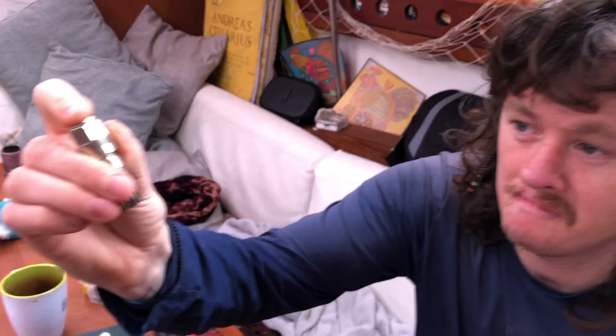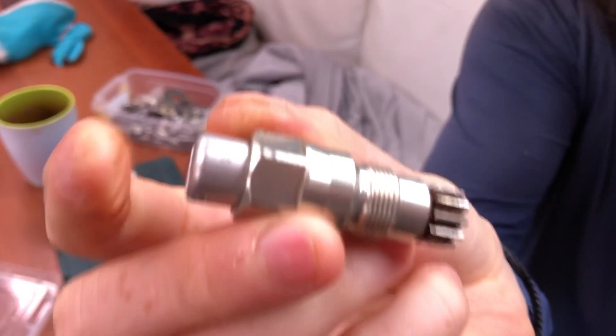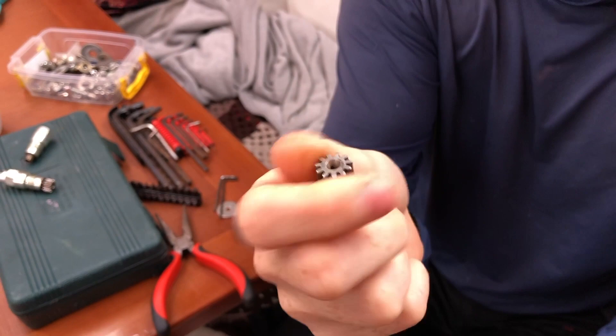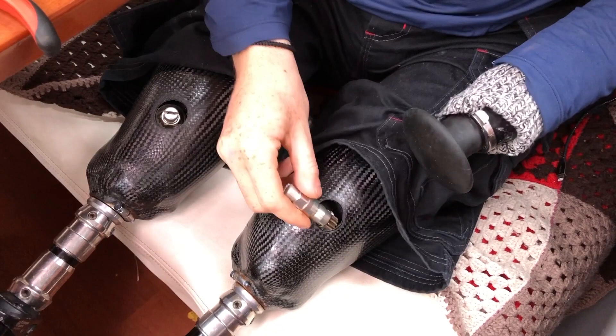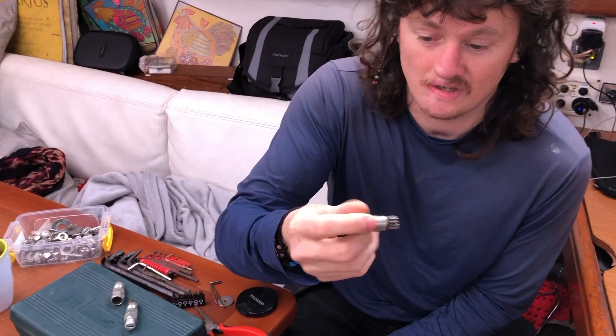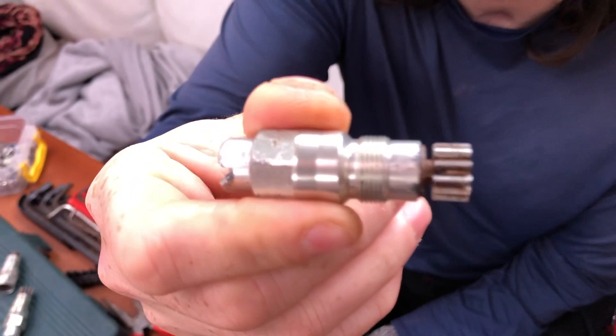These pins are for my leg. You can see this one moves in and out - that would release my leg, that would secure my leg. They can roll so that you can screw the leg on. This is a new one, this is an old one, this is another new one. This is a broken one - there's no inner working. And this one has a crack - you can see a crack down the middle of it.